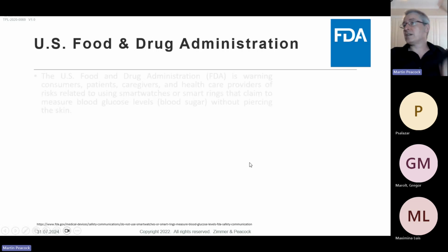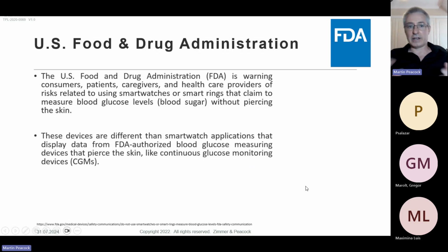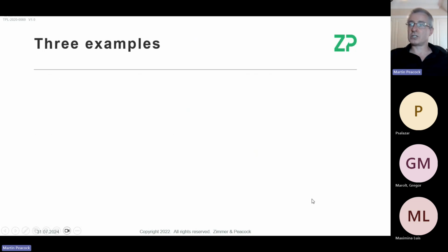And I think the FDA really put a statement out and said, look, these non-invasive glucose monitoring claims are all over Amazon. There's lots of watches out there. But they were essentially saying, if it doesn't pierce or break the skin, then the FDA is extremely doubtful about whether it's actually working. They've got to be careful with their language, and I've got to be careful with my language as well. But the FDA, you can read their statements. I just copied and pasted off this. They put out, I wouldn't be sure if I'd call it a press release, but a comment about smartwatch applications where there was no piercing of the skin. They were very doubtful about whether they actually worked.